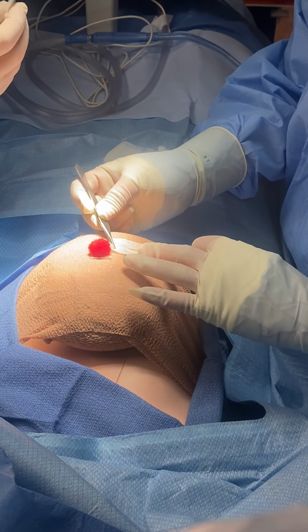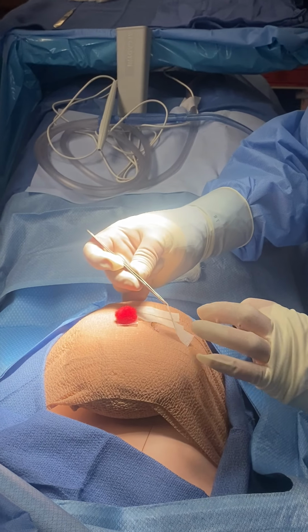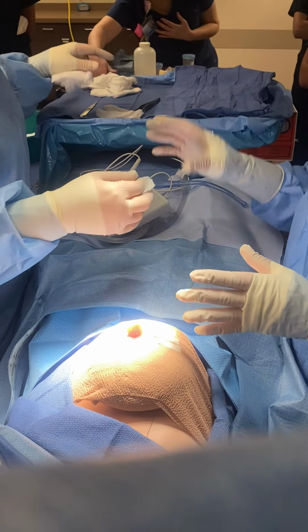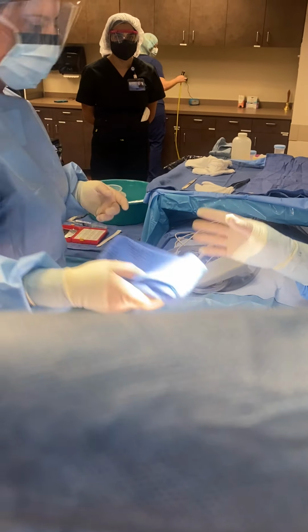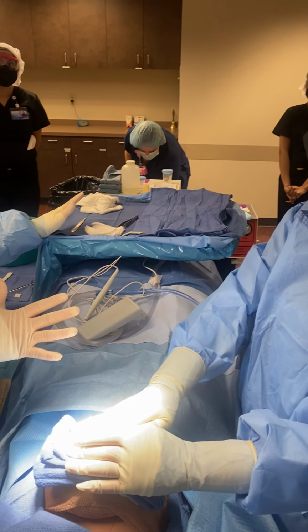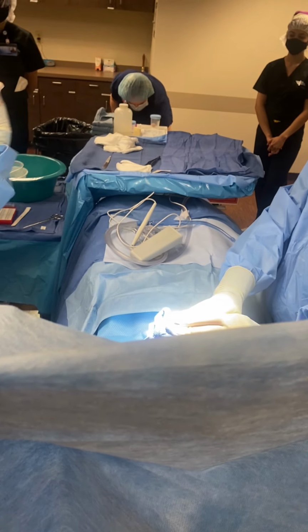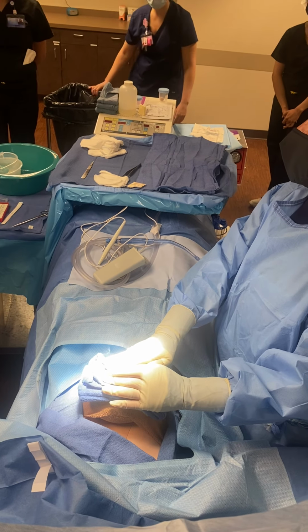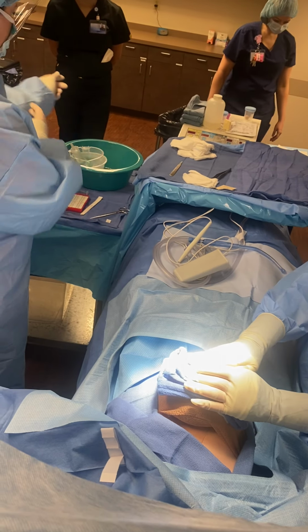Done with the Bovie? Yes, ma'am. You want to remove your Bovie tip that goes in the sharps? All right. The rest of this will be trash. Gloves. Thank you. Okay, and then everything is good with pathology, right? Everything's good. Okay, so we just want to make sure of that before we break our field. If we haven't heard back from pathology, the surgeon might just leave and break scrub and get the chart, and then we stay here and babysit until we get the call, and then we break down or move our field.